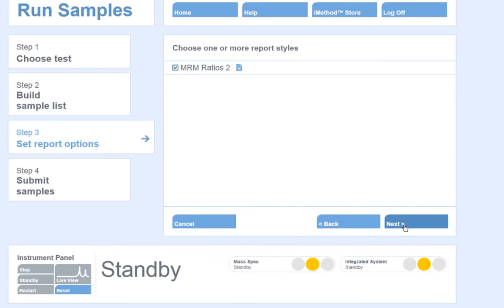Choose the report template you would like for your data. Reports can be customized for your lab, and you may have a few options available to your users. In this case, I will select to output my data for analysis by MRM ratio.